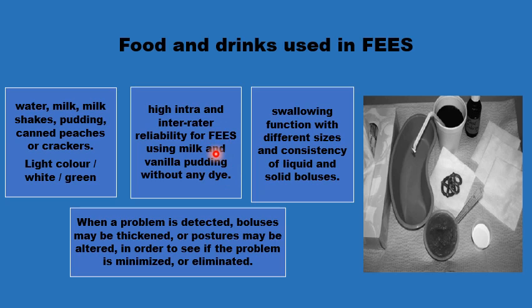The swallowing of different materials, thin fluids, thick fluids, semi-solids and solids, should be tried in ascending order, starting with the thin fluids first. If there is any problem at any point, you can start changing the consistency of the fluid, the volume per bolus, and the rate of introduction, together with other factors like the head position and the posture of the body, to test the ability of the patient to tolerate some types of food.